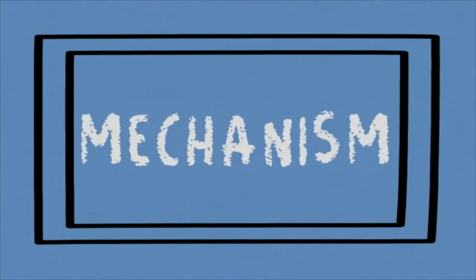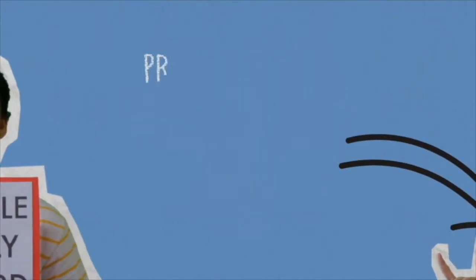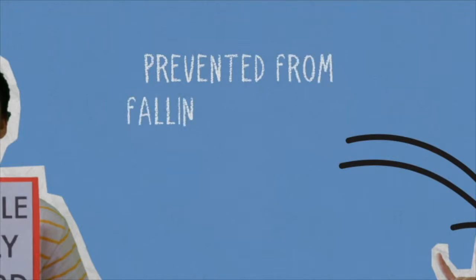Maybe you're curious how these devices help during sleep apnea. Well, it holds the airway open by bringing the mandible slightly forward while you're sleeping, and it keeps the tongue in such a manner that it is prevented from falling backwards during sleep, which can cause airway obstruction.